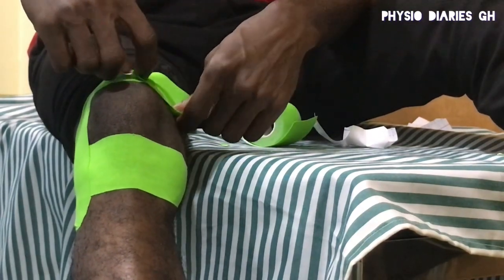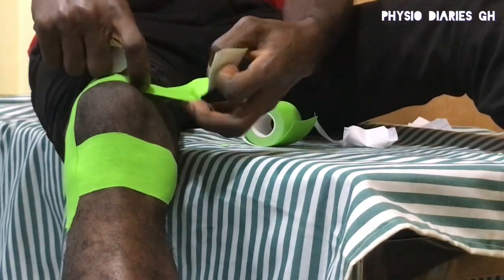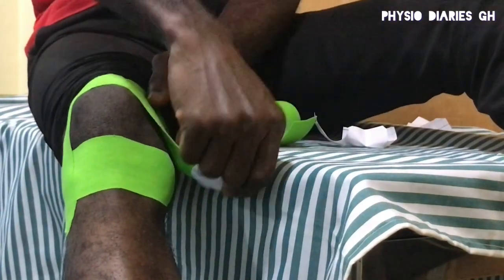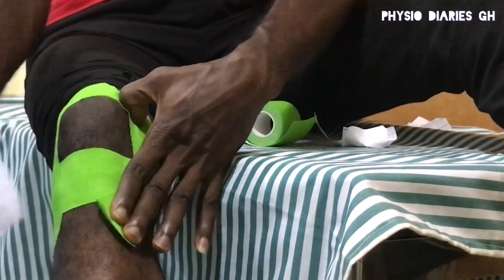Begin to apply the last one, starting from the upper thigh. Apply some stretch and then start applying, covering the medial epicondyle to the tibia.